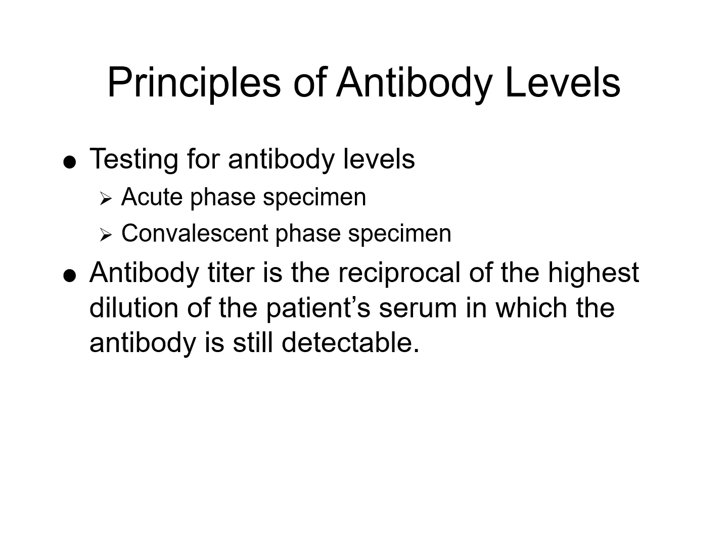For interpretation, we have a comparison of acute and convalescent titers, and it can determine evidence of recent infection if you have a greater than or equal to 4-fold rise in titer, and immune response progression over time. For best practices, we want to collect paired specimens carefully, labeling them with date and phase. We follow protocol-specific dilution and assay procedures to ensure accurate titer determination. And of course, document all dilutions, titers, and interpretations in the laboratory records.